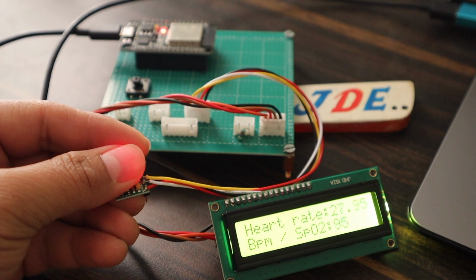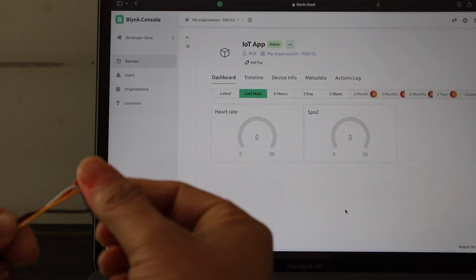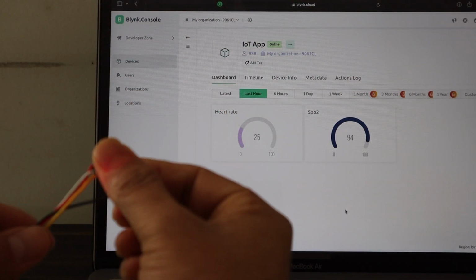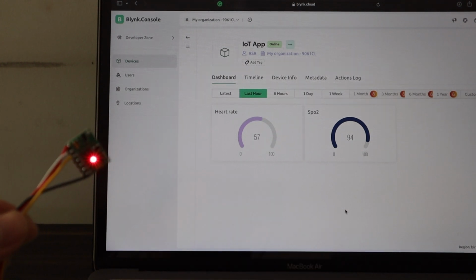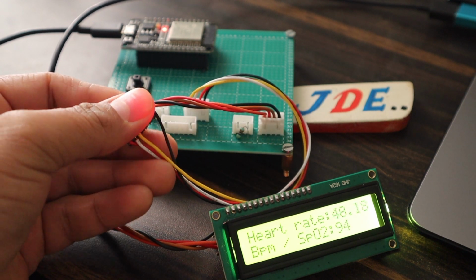In this video, I will show you how to use this MAX30100 sensor with the ESP32 microcontroller board. We publish this data in the Blynk app, publishing the heart rate data and the SpO2 level, and also display it on this 16 by 2 LCD display.